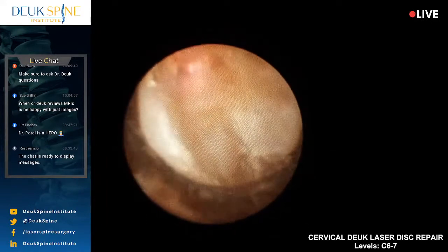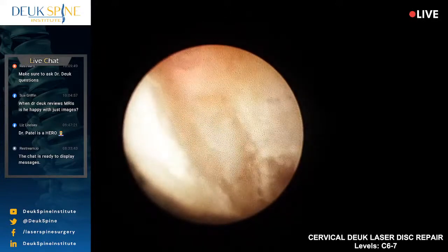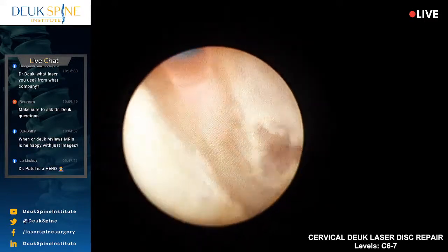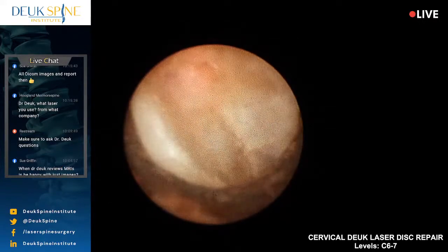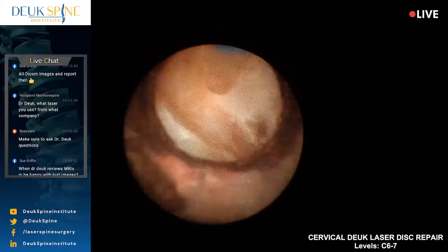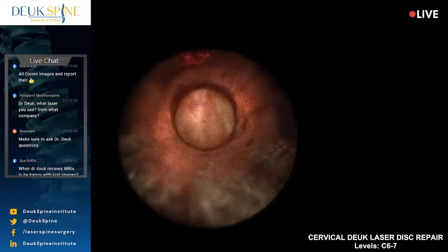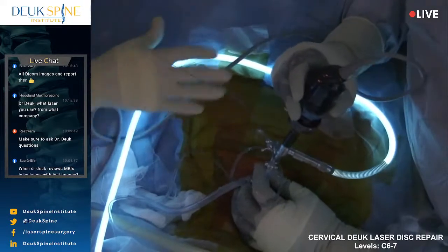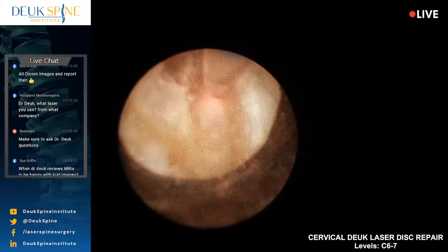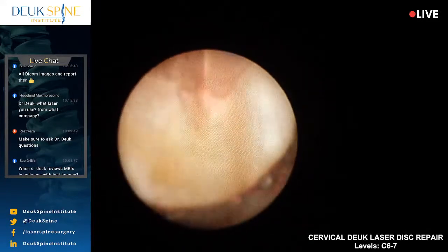So in the ideal world, I have a little history, which is why we have a history form you have to fill out. I have the radiology report and I have the DICOM images, okay? That's the ideal situation for me, to help people figure out what's wrong and how to fix them. A lot of scar tissue here. That's a piece of herniation right there.